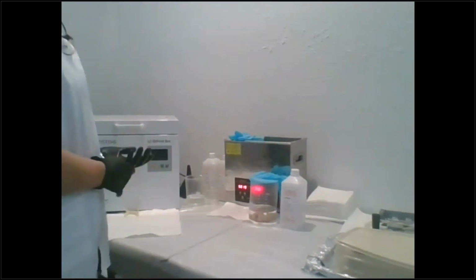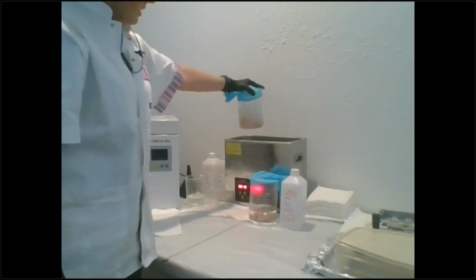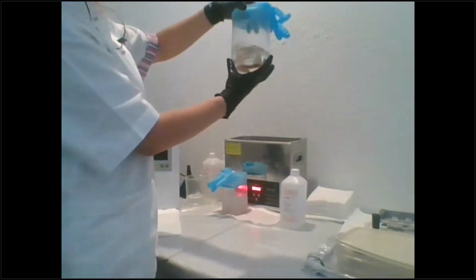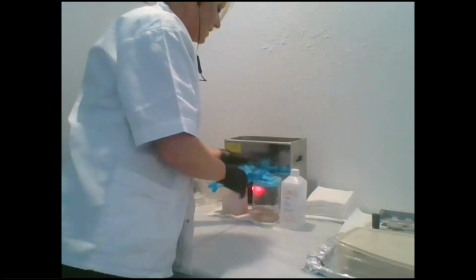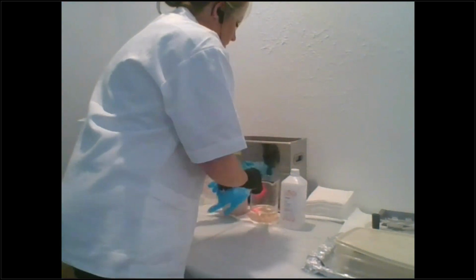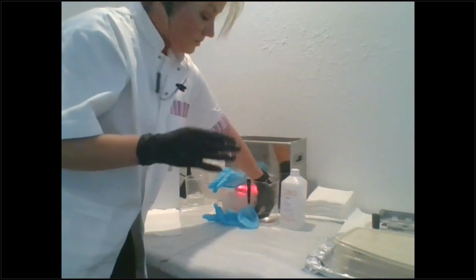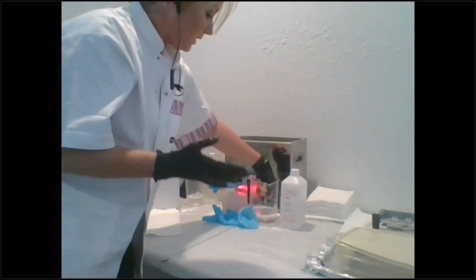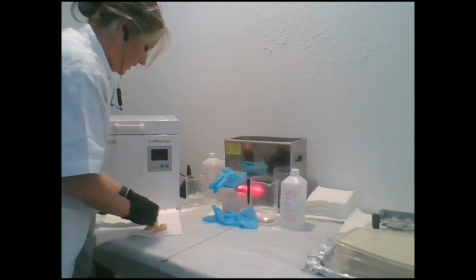Now, when your ultrasonic is done, you can dump your dirty bath or whatever, and I always have a second one for my clean bath. And so these are the ones I did earlier because I didn't want to put that sound in your ear of the ultrasonic. So when they're done, make sure that you don't let them sit in there for longer than the 3 minutes and the 2 minutes, because it'll start eating away, especially if it's a biocompatible part. You don't want it to get weak from the alcohol eating at it. And you want your dyes to fit properly.